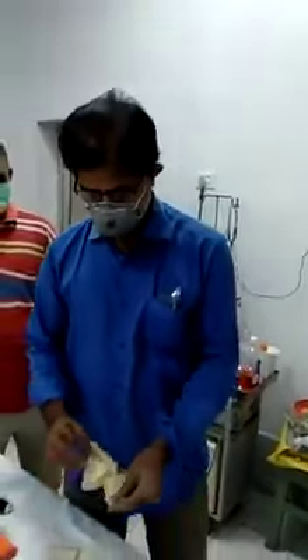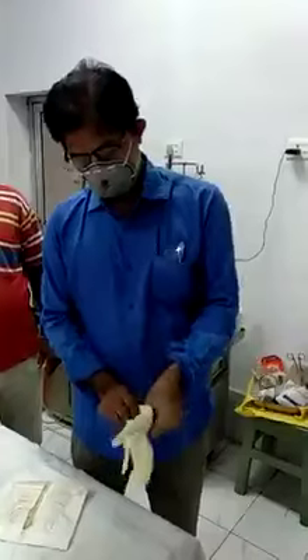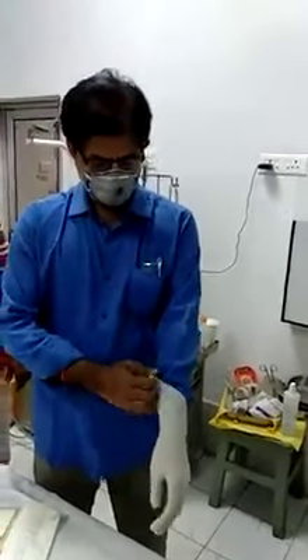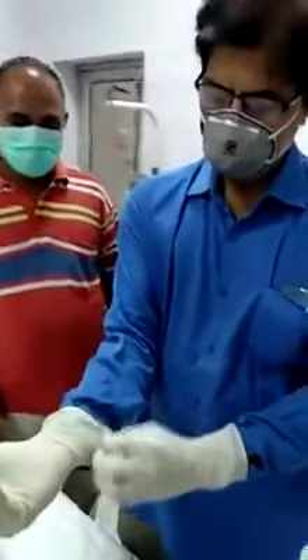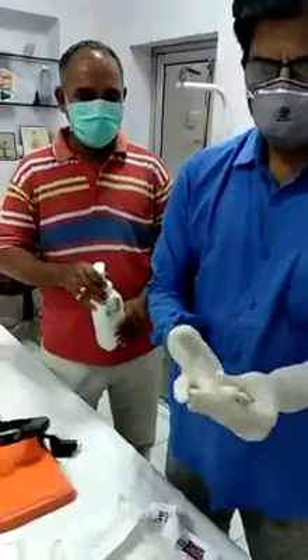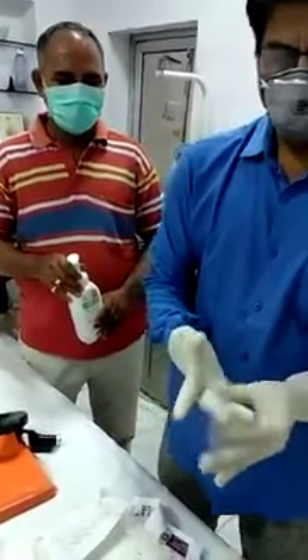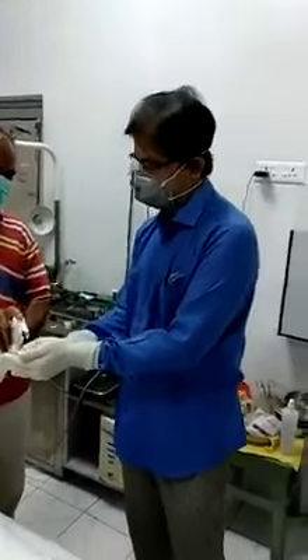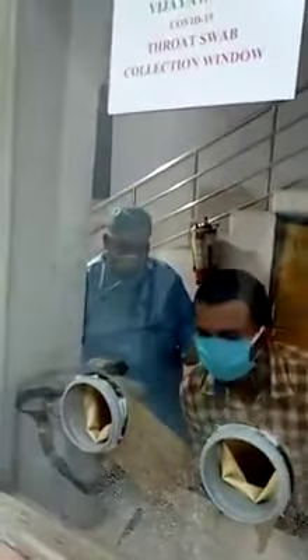This is the second case for which the sampling will be taken by Dr. Ravikant. Getting ready — always sanitizing the hands with sanitizer. The patient is also ready; the area has been sprayed again.